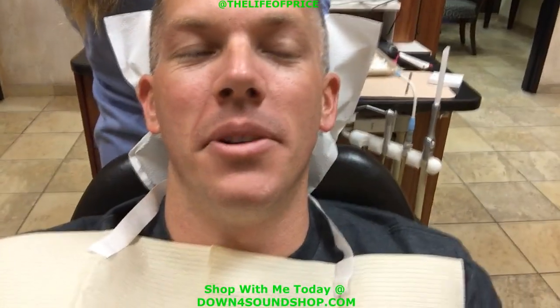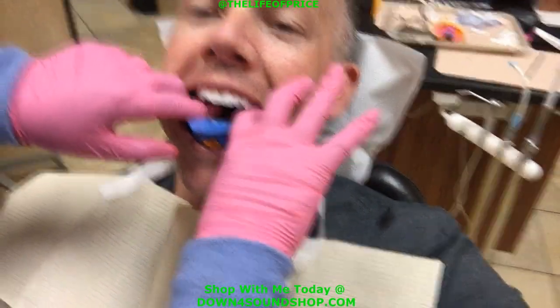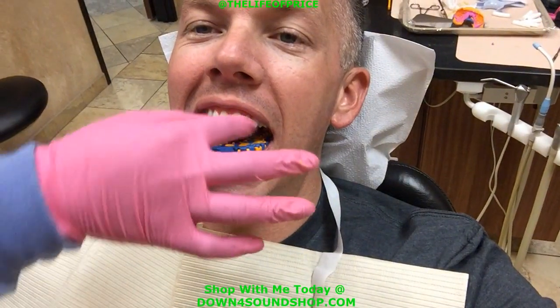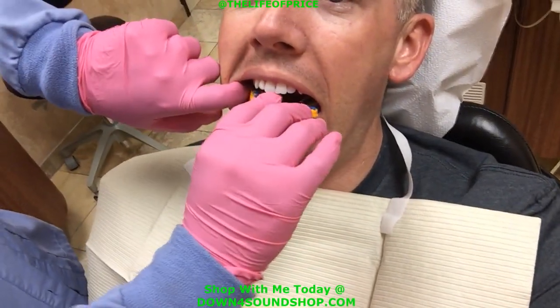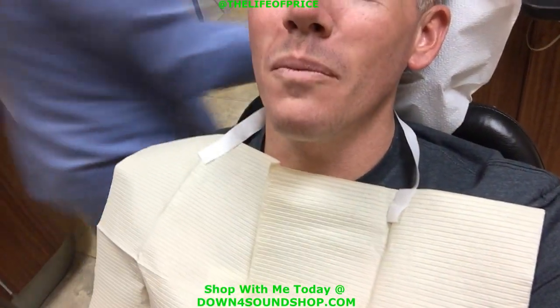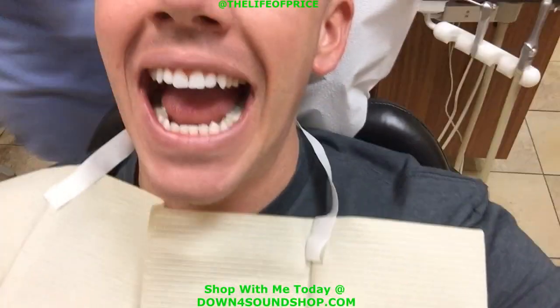So we got the top impression done. All you gotta do is the bottom. Hopefully I'm making good impressions. Alright, let's get to the bottom. Sorry for the pressure there. Four minutes again, okay? Here you go. Mouthful, sorry. Okay, I'm gonna grab one more thing.